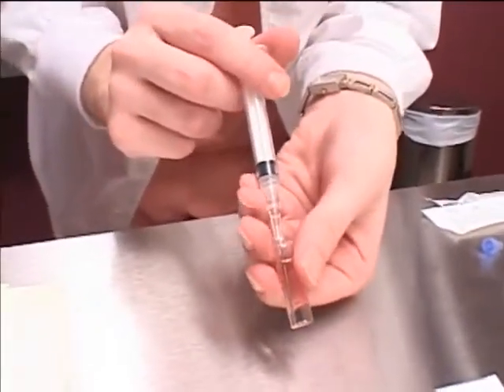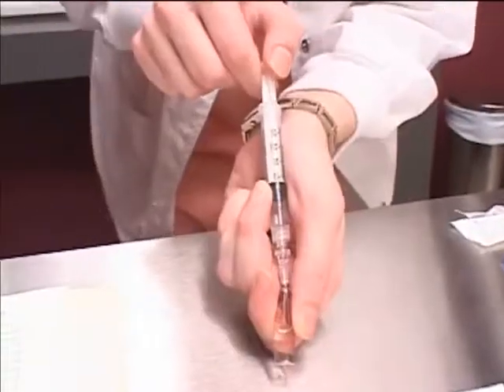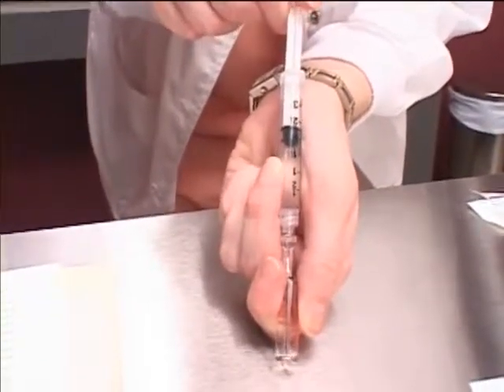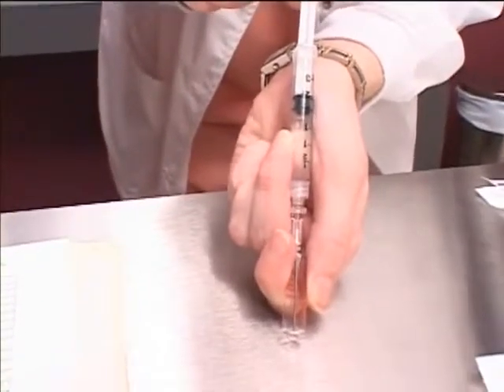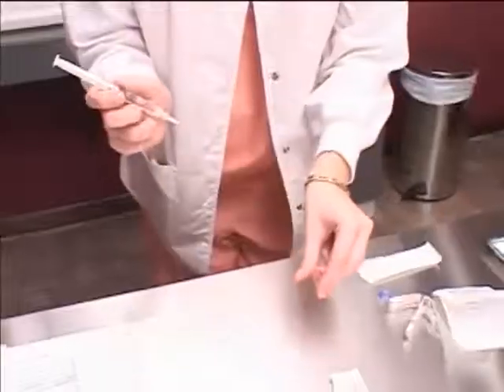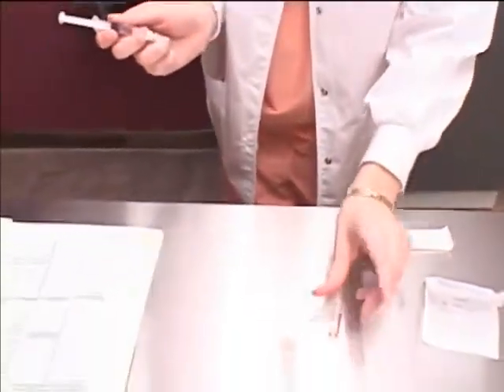Insert the filter needle below the level of the liquid and gently draw the liquid into the syringe, tilting the ampule as needed to access the liquid. After drawing up the medication, remove the filter needle and place the ampule on the counter.